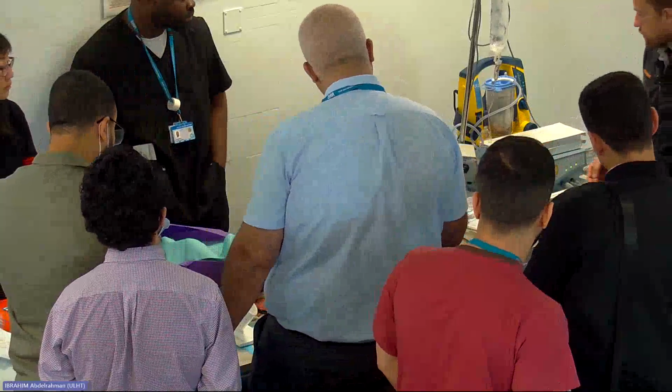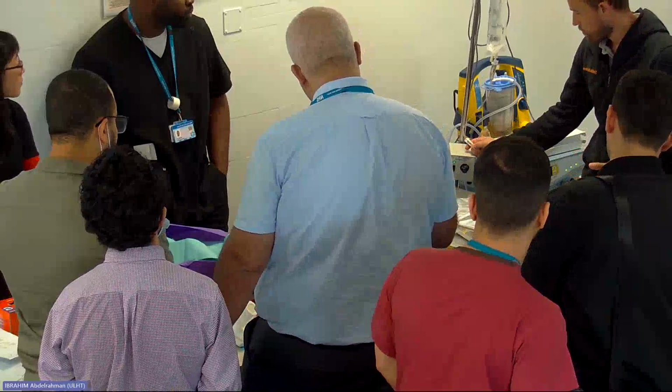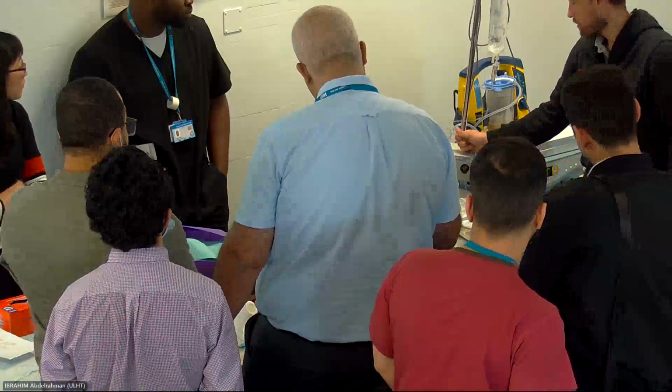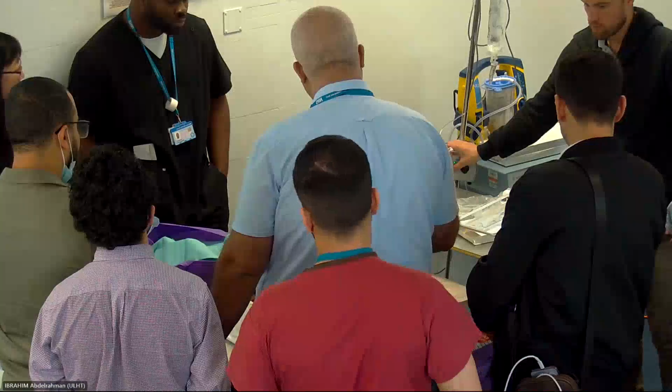So those are the two things you need to check, then prime it. We'll open it up for me. You need to open it up like that, or you can put your foot on the foot pedal. We'll open it up. Once saline comes out at the end, it's on its way.